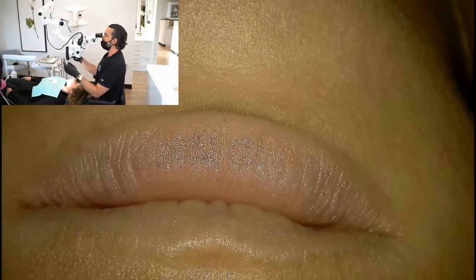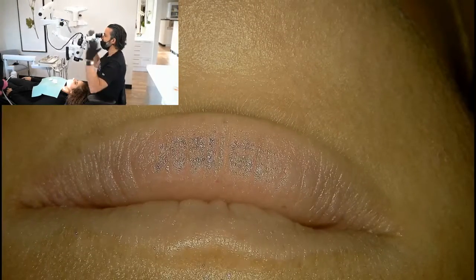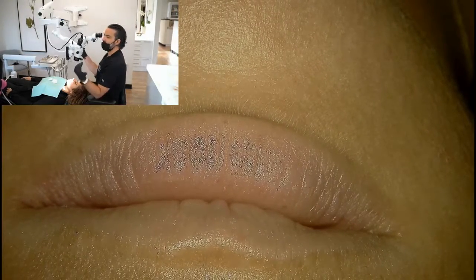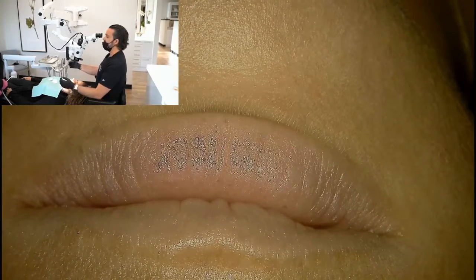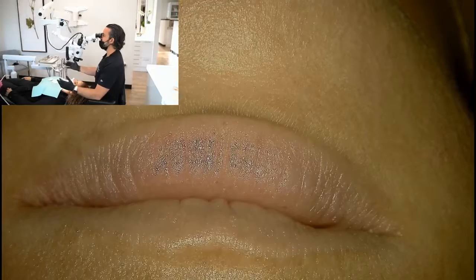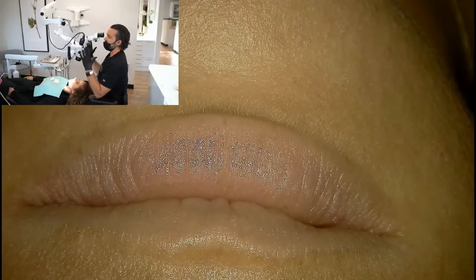When you do that, you have a little bit more wiggle room. You feel less tight. Now your peripheral vision's opened up. You can look out of the corner of your eye. Your neck's not doing this thing. You can look side to side with ease. And the other thing is then you're not touching your microscope. And when you're at higher magnification like this, then it's something that's.